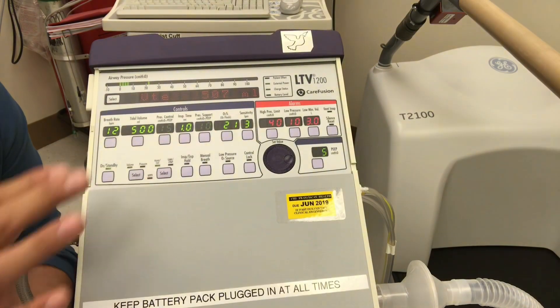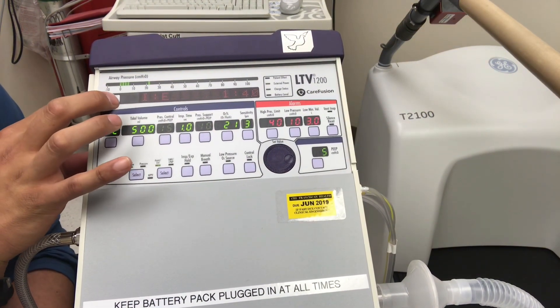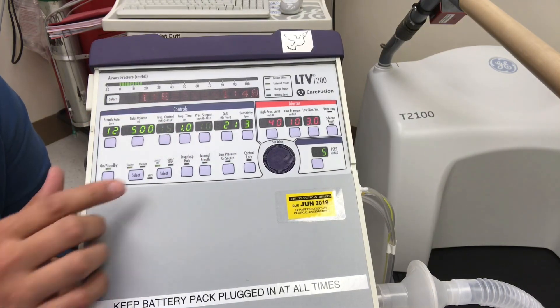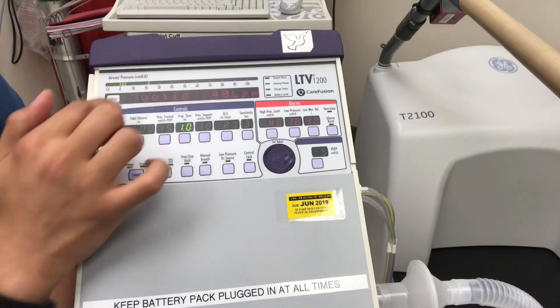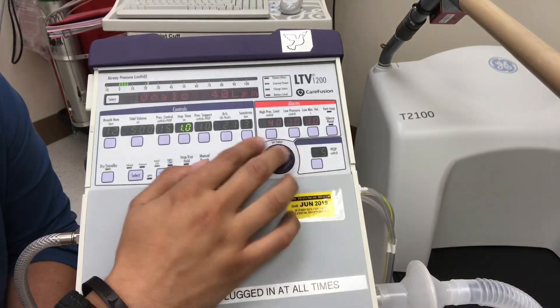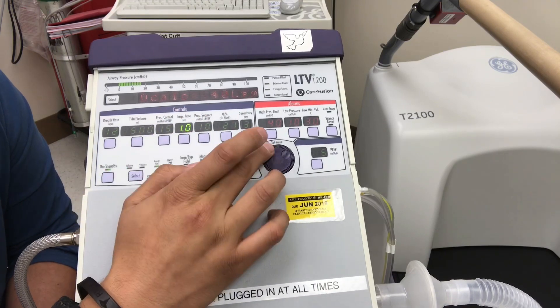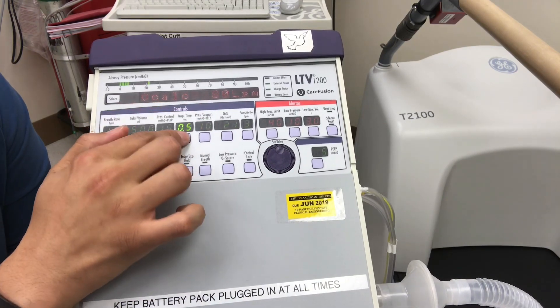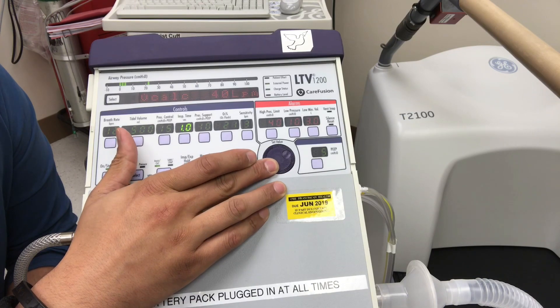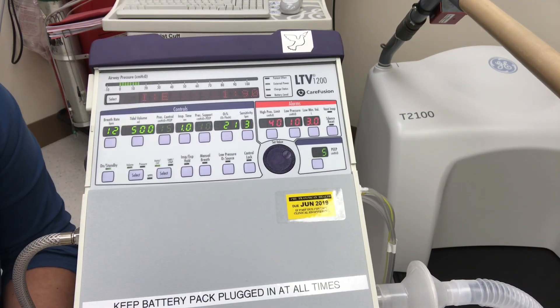Let's look at the I:E ratio — that's the inspiratory to expiratory ratio. To adjust this we adjust the inspiratory time. Touch the control and notice we switch to flow. If we want a longer expiratory time, we shorten the inspiratory time — from 1 second down to half a second. Notice the flow changes, and now the I:E ratio changes from 1:4 to 1:9. Going back to 1 second, the I:E ratio returns to about 1:3 or 1:4.